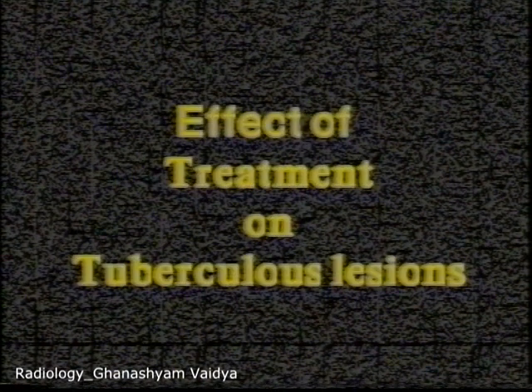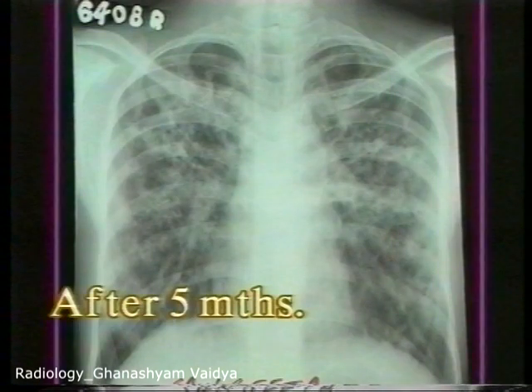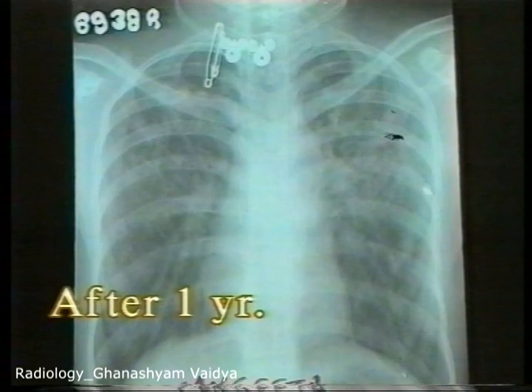Now before we move to the pleural lesions, let us see some tuberculous lesions and the effect of treatment on them. This is the first X-ray before starting chemotherapy, showing extensive lesions involving both the lungs. Note the fluffy appearance of infiltration. This is the second X-ray after 5 months. Now the lesions are more sharply defined and fibrotic, and infiltration shadows have reduced. And the last X-ray, after 1 year of chemotherapy, shows complete healing with minimal residual fibrosis.